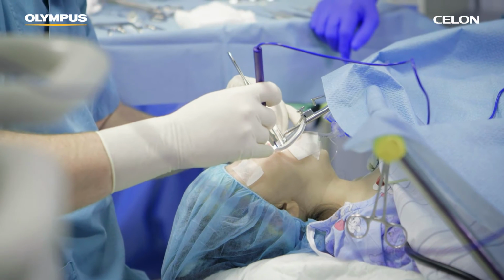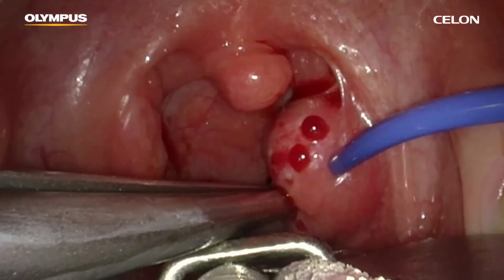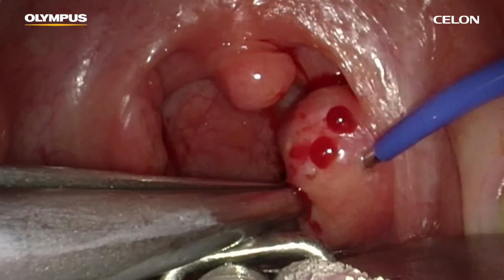You can monitor the status of coagulation via the acoustic signal. The power supply is reduced automatically to prevent overdose effects.